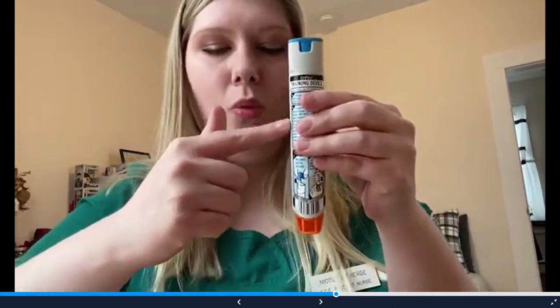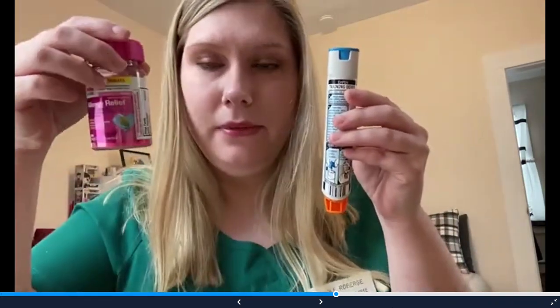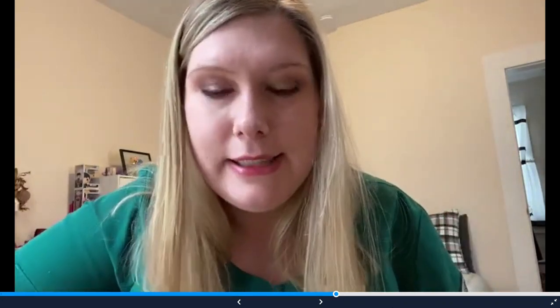So you might be wondering why you might have to use this versus a pill. Well, here's the thing. Pills don't always work as fast in a serious situation. So epinephrine, once injected into your leg with the needle, works at lightning speed. It's gonna go zoom right through your body and help you right away. So that is why when you're having anaphylaxis, we're gonna learn how to use that, because it's a very, very important part of saving your friend.